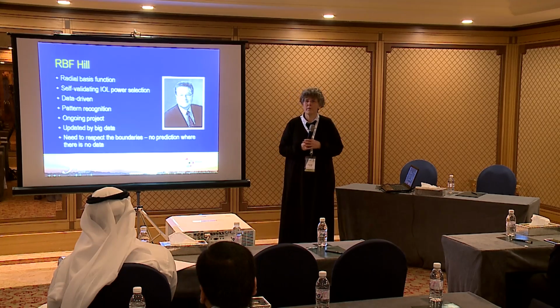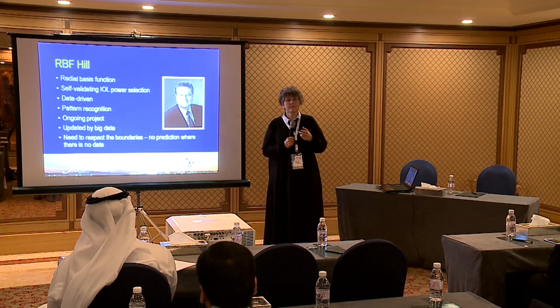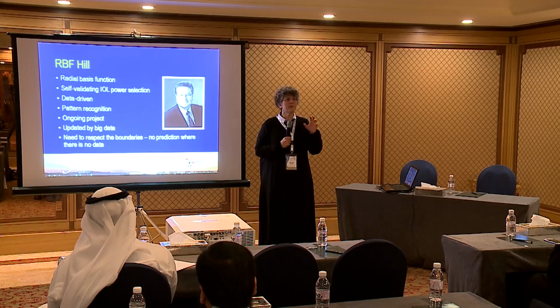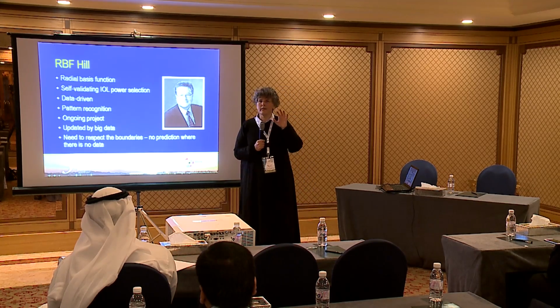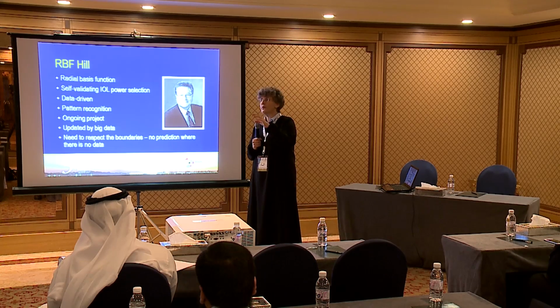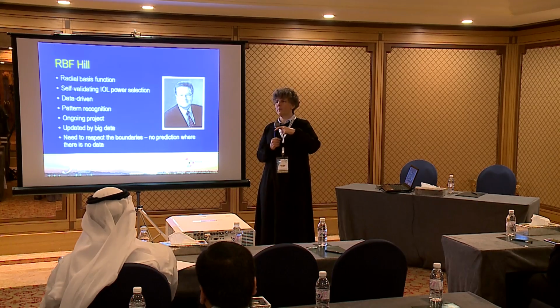He's a very famous American cataract surgeon, and he has this website, and he is really the guru, I think, of lens calculations. And now he has come up with a different thing. He teamed up with engineers, and they decided they're going after big data. We're measuring lots of data all over the globe, and he has used in his new calculator the data of 230,000 eyes that were already operated upon.